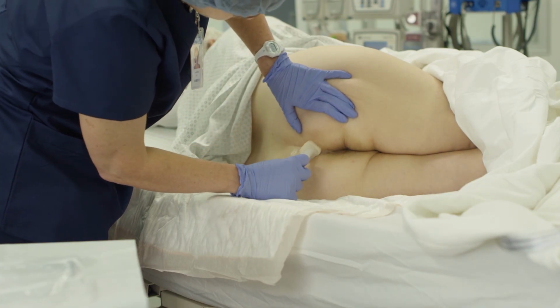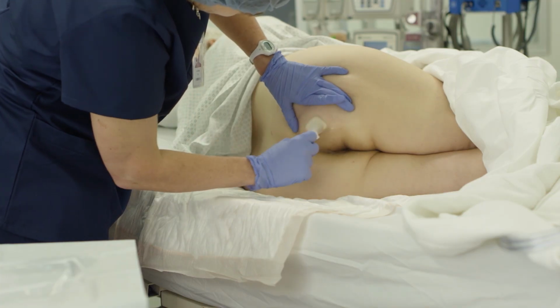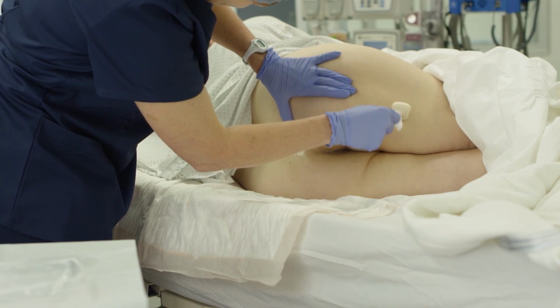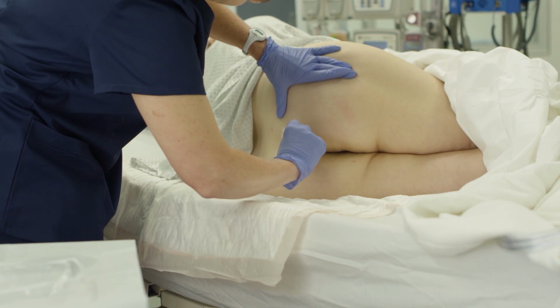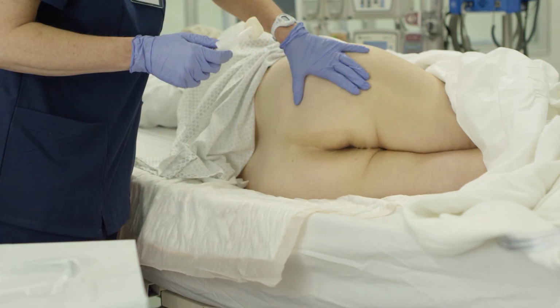There is no need to push down on the applicator during application. Additional pressure is not needed and can result in excessive wetness or pooling of fluid. To facilitate easy application, the applicator may be used in any direction. Apply the protectant to damaged areas of the skin, as well as any areas of intact skin that could be exposed to stool or urine and are at risk for damage.